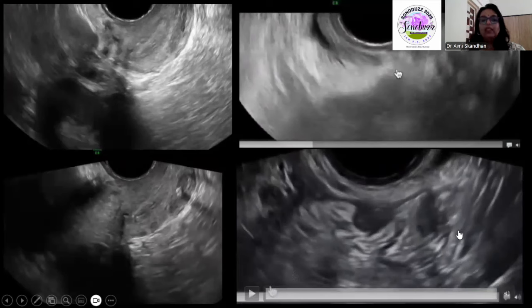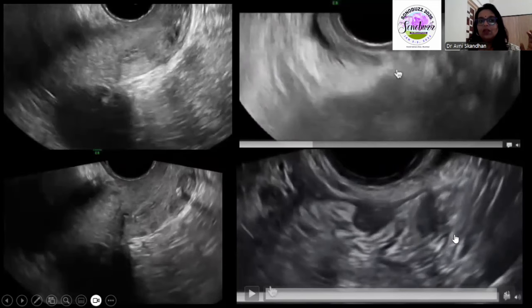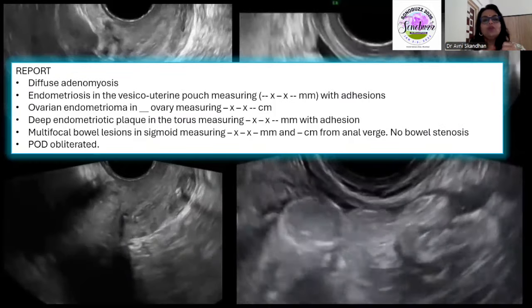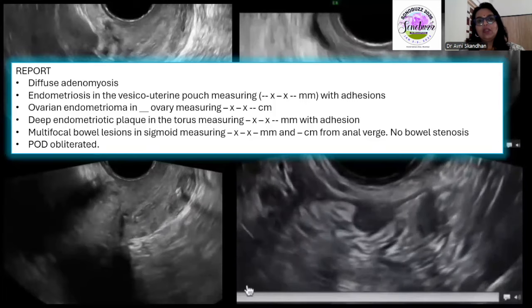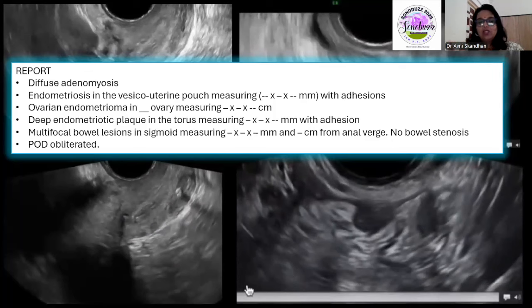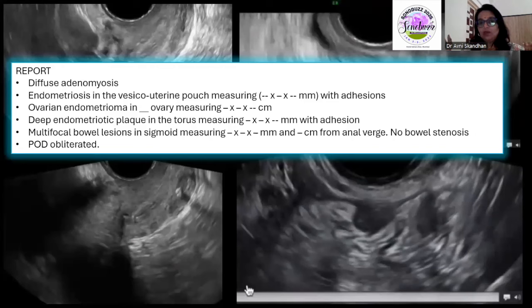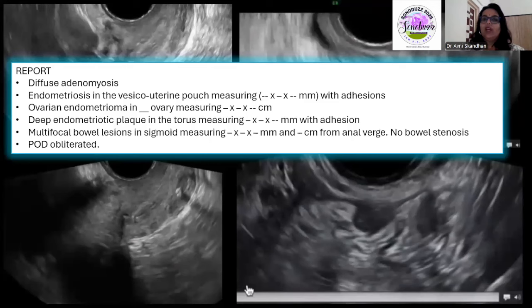How would you report this case? You have to mention the patient has adenomyosis. You have to say there is an endometriotic deposit in the vesicouterine pouch with its dimensions and adhesions. Mention the presence and measurement of the endometrioma. Describe the endometriotic plaque at the level of the torus uterinus and adhesion with the ovary. State the multifocal bowel wall lesions, their measurement, and the distance from the anal verge. Mention whether there is bowel narrowing, and because the sliding sign was negative, state that the POD is obliterated.